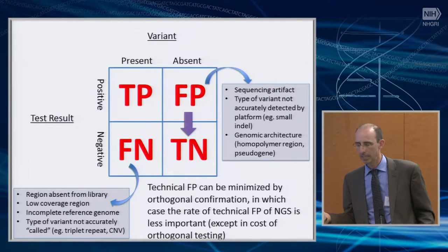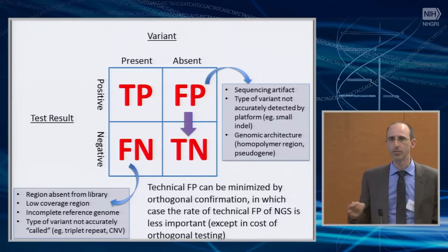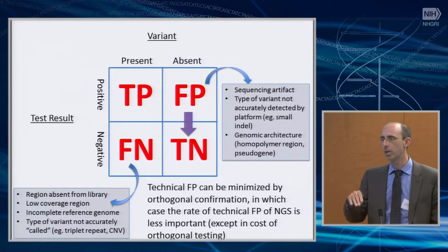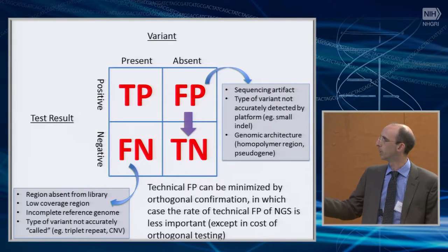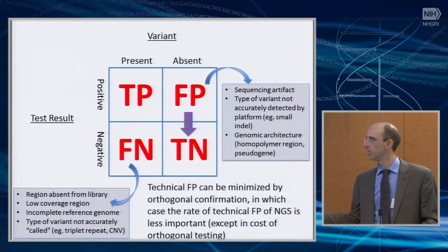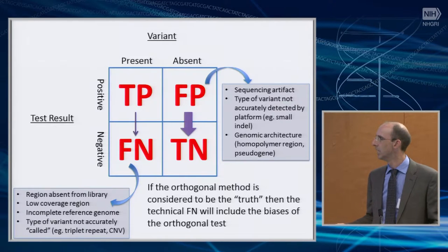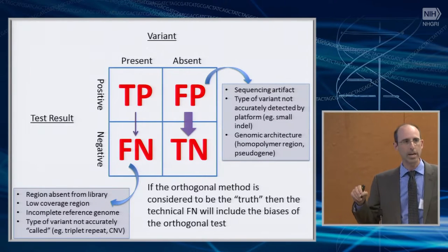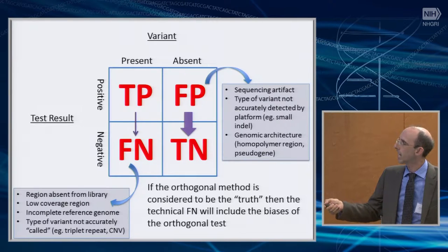Now, in this case, it actually matters a little bit less how many false positives the sequencer is going to give you if you have a secondary method to adjudicate those, right? So this is an important consideration if you think about what your device is. If your device includes secondary confirmation in which you're going to be able to eliminate some of the false positives, then that needs to be considered the device. Now, there is a cost in orthogonal testing in that if you are having to go and confirm 10 predicted variants for every one real one, then that's a research cost that you have to think about, is that the right decision? So the other sort of possible consequence there, and this gets to what Stephen was saying, is if the orthogonal method is the truth, so if Sanger sequencing is the truth about that variant, then you're going to actually lose some true positives, and the rate of this is going to be critical, right?